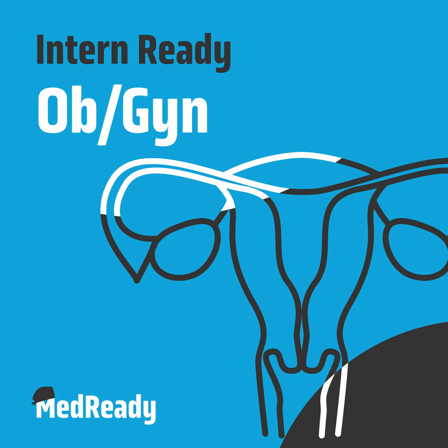One, what is the size of the uterus? I want to know this because when I'm dilating, I want to know in my head how far out the fundus is because I don't want to dilate past what I know is already listed on the imaging as the measurement. And then I also want to look for any location of focal areas of pathology. That way I can kind of know where to direct my hysteroscope in the OR.